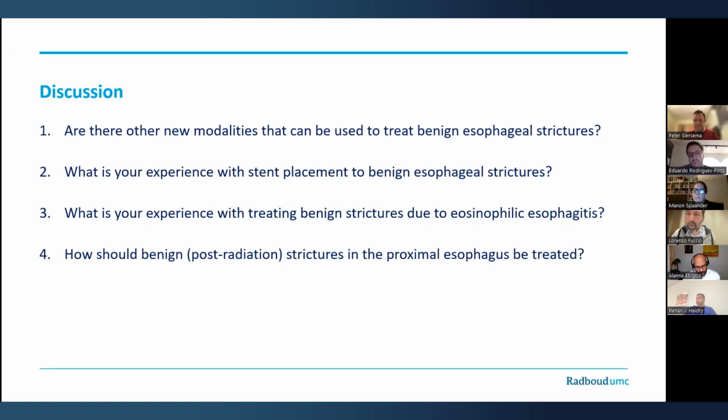Excuse me, Peter, could you repeat, because my connection was not very good. I can't hear you very well. Well, we still, of course, also have these peptic strictures with hernias. Is that another type of procedure, or is it also one of the dilations that we do for stricture management?